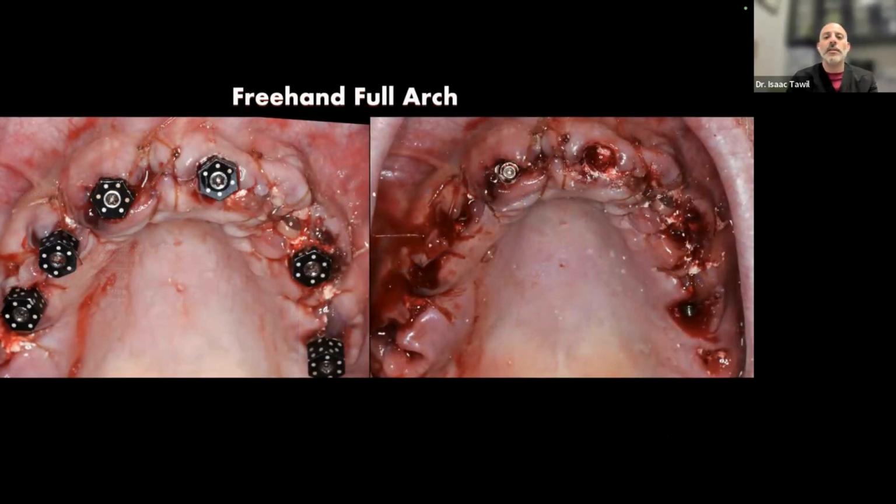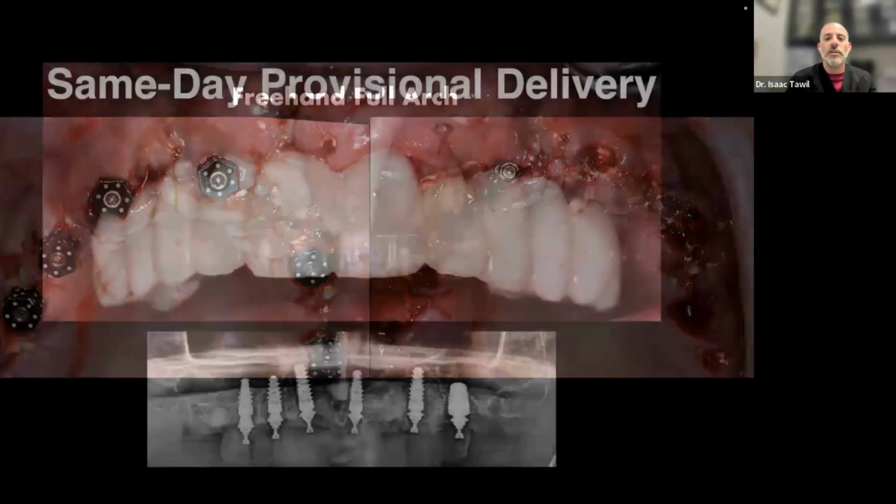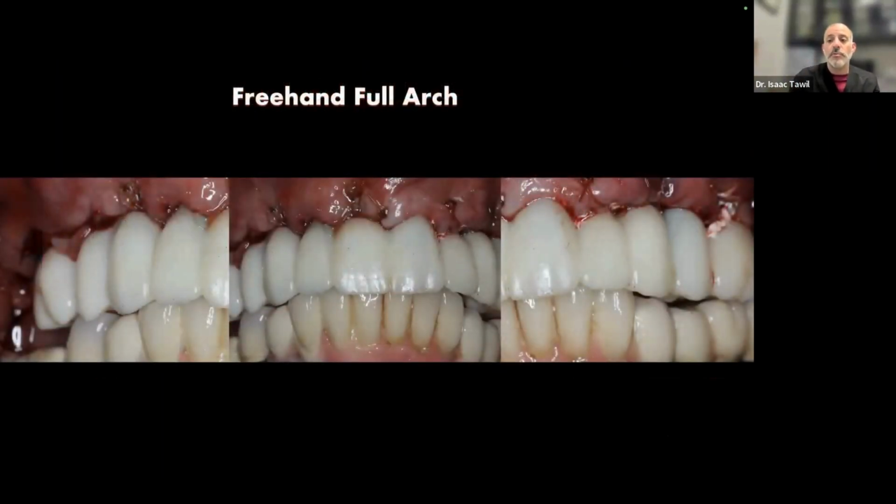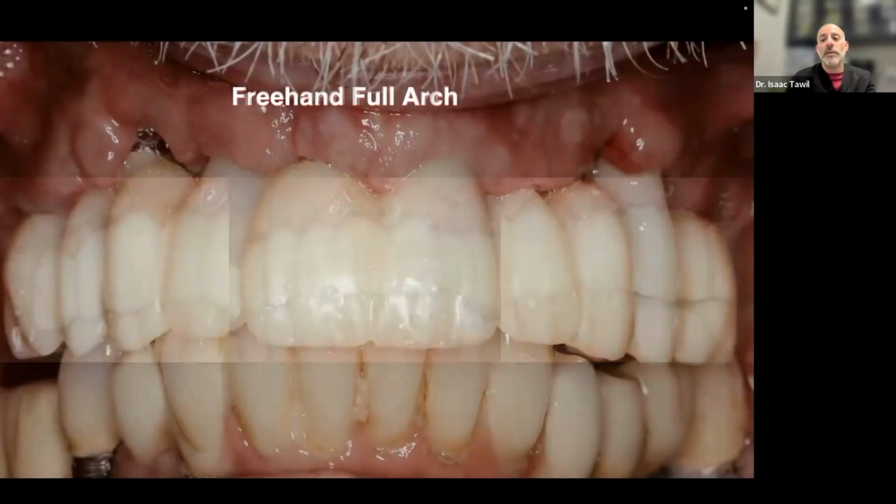I remove these CAP scan bodies that we use only for surgery. We insert an FP1. You can see the implant seating is quite nice on the lower x-ray. Everything's looking really well. You bring them back. You can see the bite was pretty good there as well. And we can bring him back and see the post-op. He's healing pretty well for a patient.